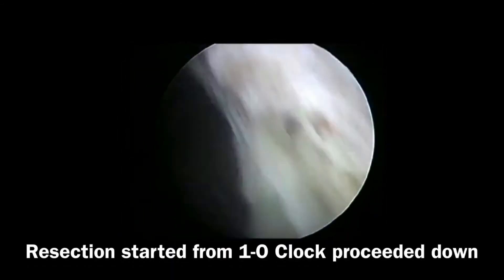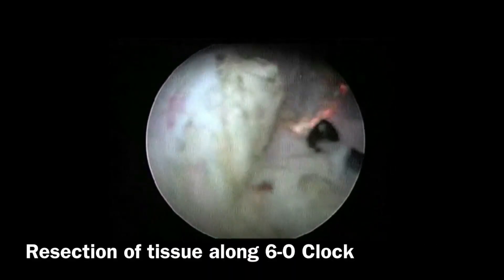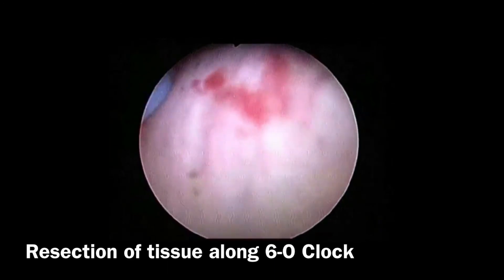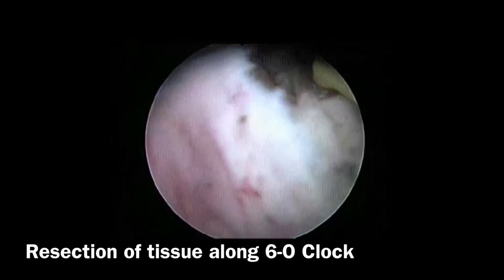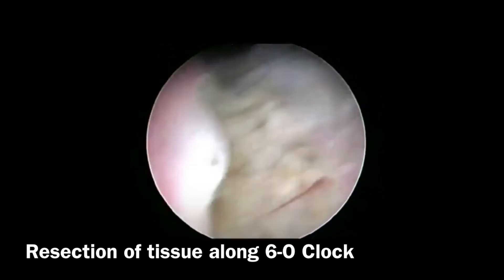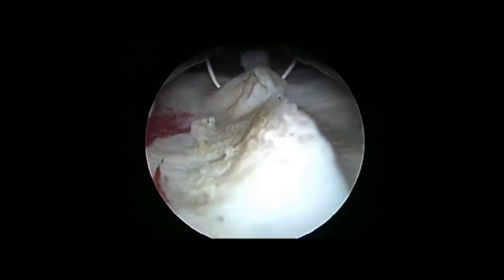The resection is proceeded from the 1 o'clock along the capsule up to 6 o'clock. Once the lateral lobes are finished resected, we now concentrate on working along the 6 o'clock portion — that is the resection of the median lobe. The resection is done in the same manner as the lateral lobes, proceeded up to the circular fibers making sure that Veru is not crossed. As we work along the median lobe, we can note that there is not much bleeding as the gland is devoid of blood supply.